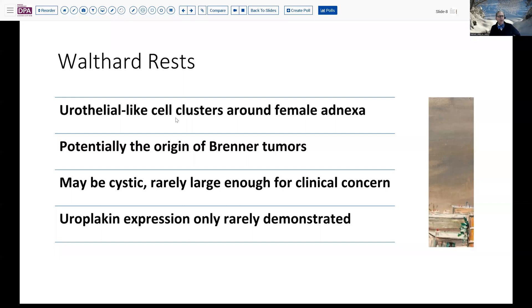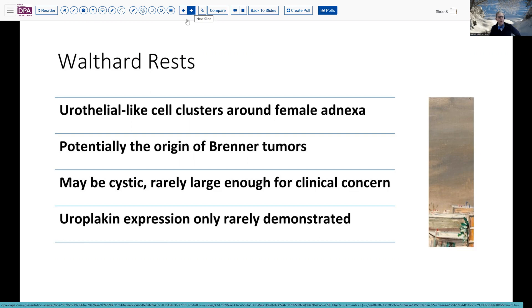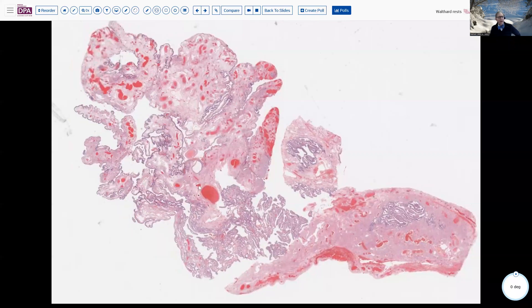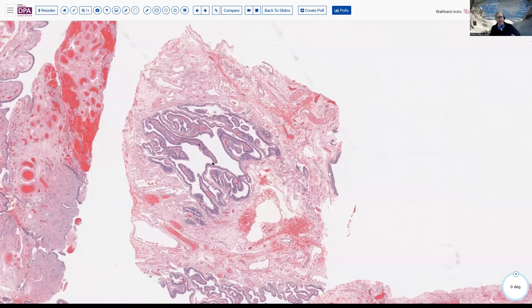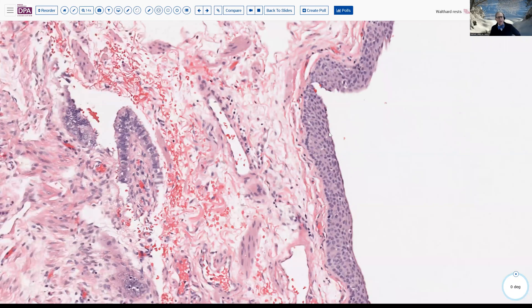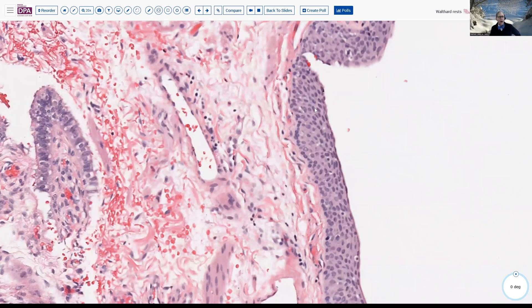Finally, to touch on Walthard rests: these are urothelial-like cell clusters that occur along the adnexa, primarily the fallopian tube. Some think they may be the origin of Brenner tumors and may become cystic, as in our first slide, but these are rarely large enough for clinical concern. Their urothelial or transitional neoplastic origin is questioned by the fact that uroplakin, usually a good marker of urothelial differentiation, is not demonstrated with any consistency. Most of the time you may look at a slide and not even see them. Here you can see a little cluster of stratified epithelium with a sort of umbrella cell surface — a little Walthard rest, not cystic in this particular case.